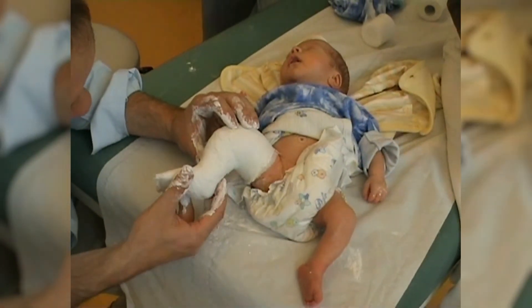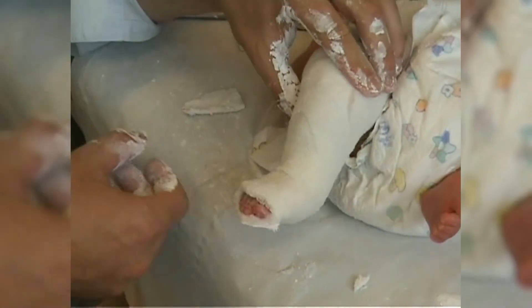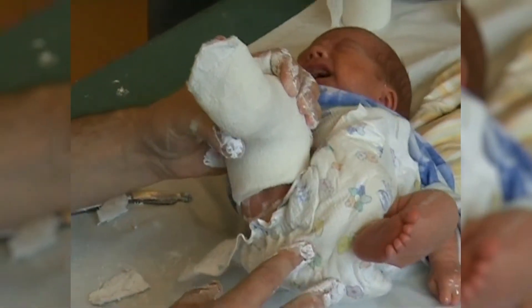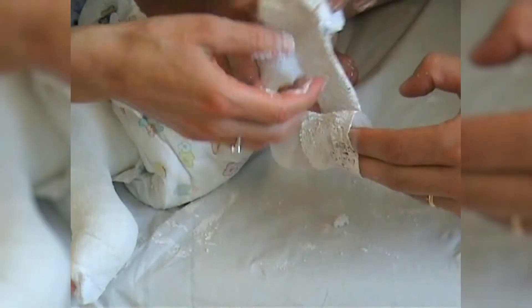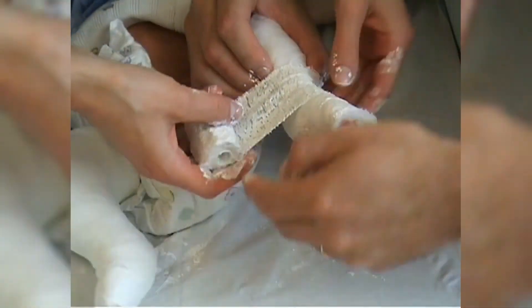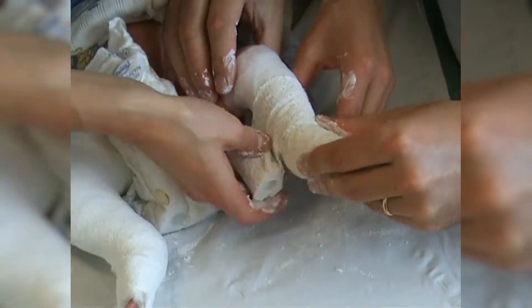The plaster cast fixes the knee in 90 degrees of flexion and the foot in about 10 degrees of abduction. You can already see the future correction of the equinus. The cast is applied in the same way on the left side. The supination component during manipulation is visibly reduced now and the foot is increasingly manipulated into abduction.